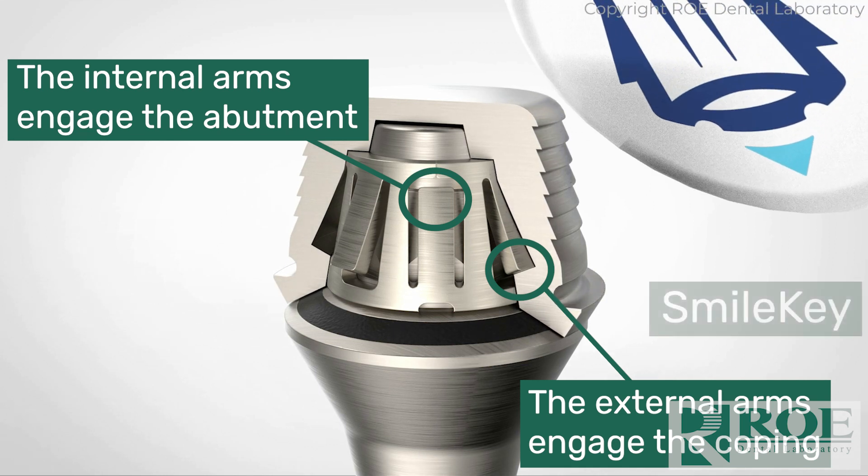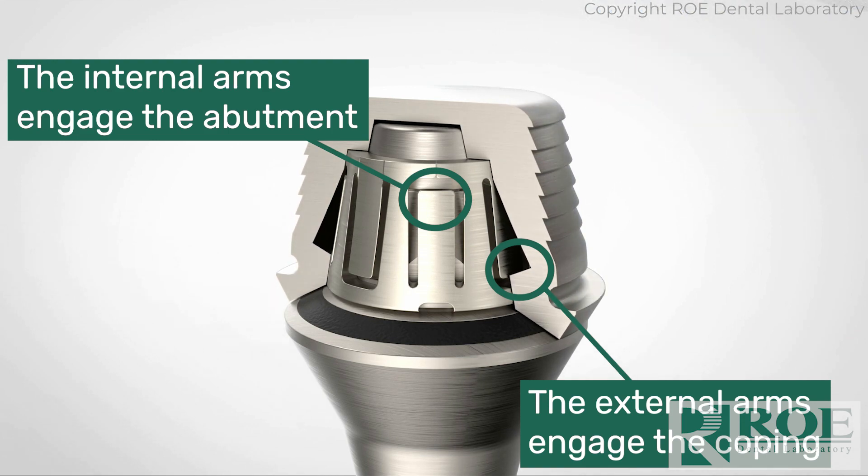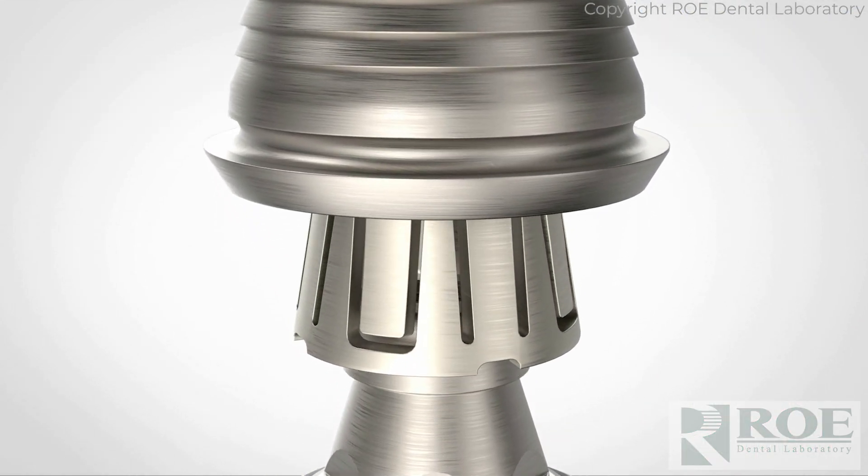When subjected to heat from the smile wand, the arms retract, allowing for quick and easy separation of the coping from the abutment. It's an amazing technology with tons of benefits to the patient.